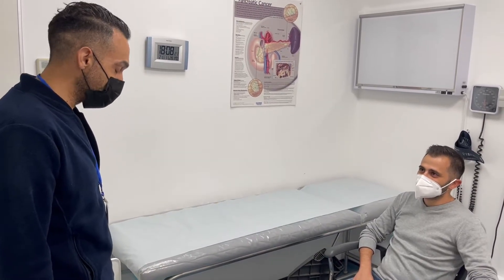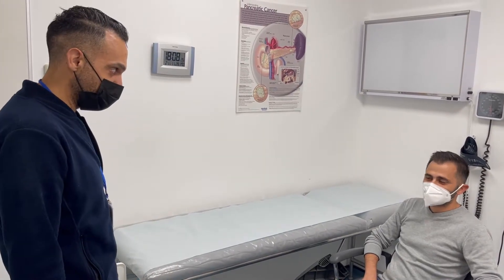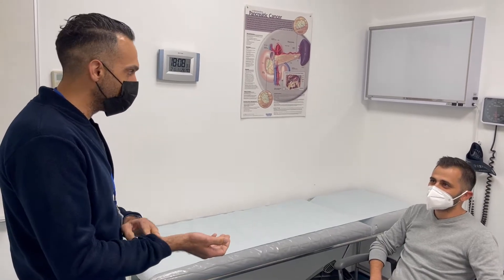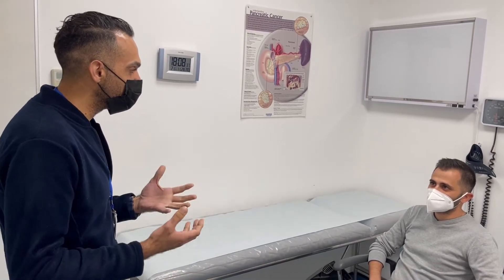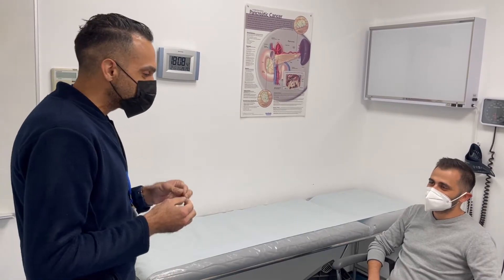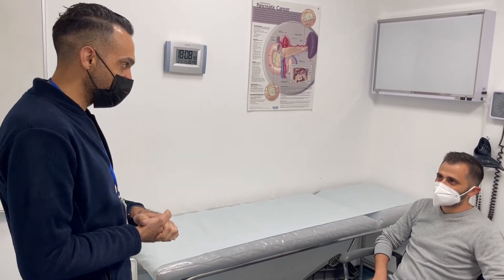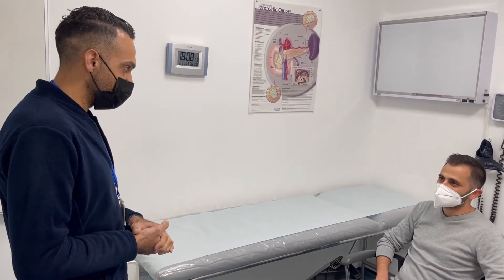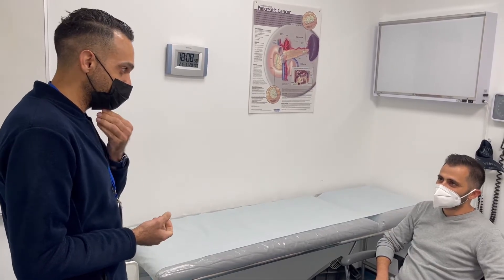Today I've been asked by my supervisor to come in and perform an ABG analysis. Have you ever had one of these done before? No. So it essentially involves taking a tiny amount of blood from one of your wrist arteries and running it through an analysis machine, so that we can see how well your blood is being oxygenated. It might be slightly painful, but it shouldn't be too painful. If there's any severe pain, you can always let me know and we can stop. Since I'm a medical student, I am being supervised, so my supervisor might need to repeat this procedure if I fail to do so. Are you still happy to proceed?